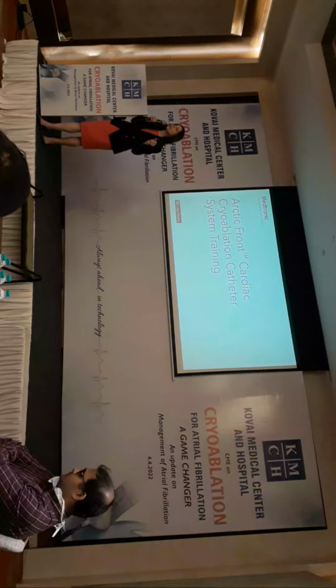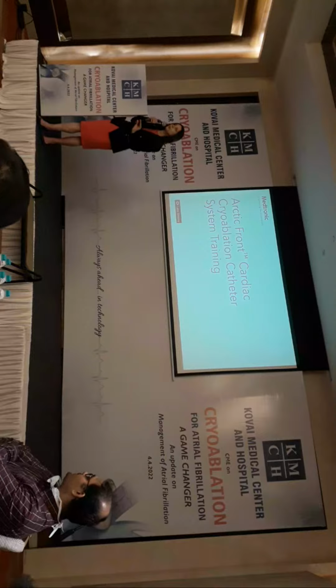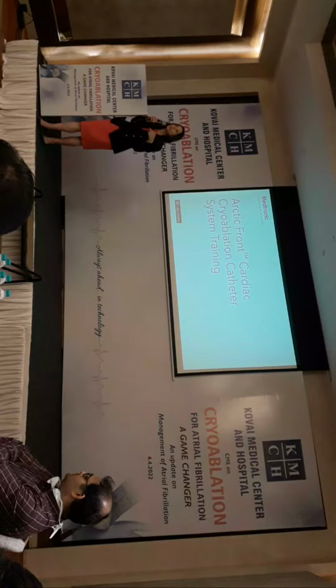So the Stop AF First trial really brought to the forefront that offering PVI ablation for symptomatic atrial fibrillation, one occurrence or more, was appropriate because the risk of the procedure with the cryo balloon is so low. Procedure time is low. It's not a zero risk, by the way, but it's low. And the benefit is greater with fewer side effects than for people who are starting one antiarrhythmic after the other. And I'm sure you've had those patients. You might start with a 1C with flecainide or propafenone, and I'm not sure how much sotalol or dofetilide is used in your country, or amiodarone. And patients are having symptoms, side effects, drug-drug interactions.